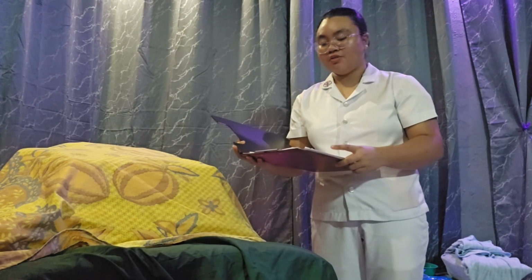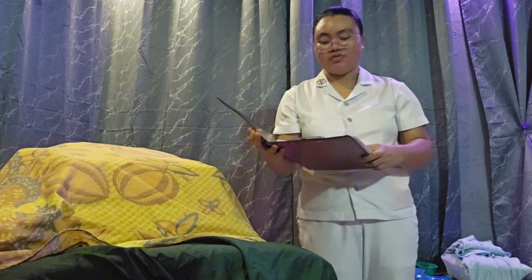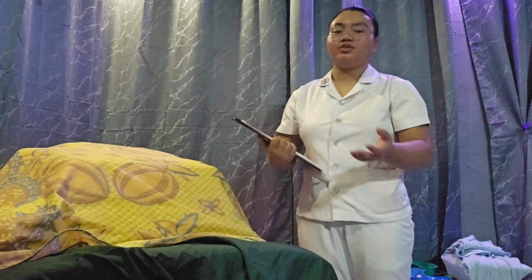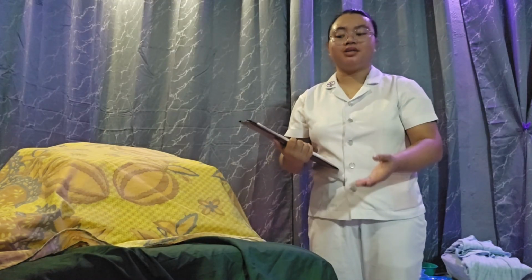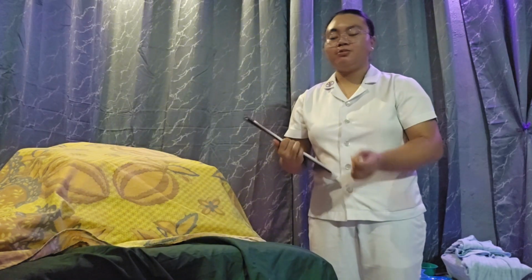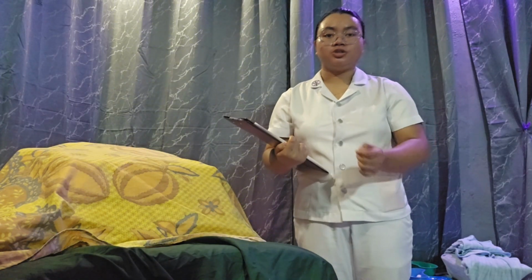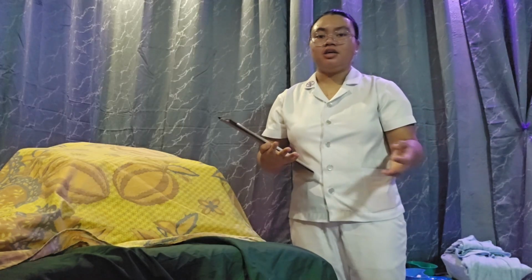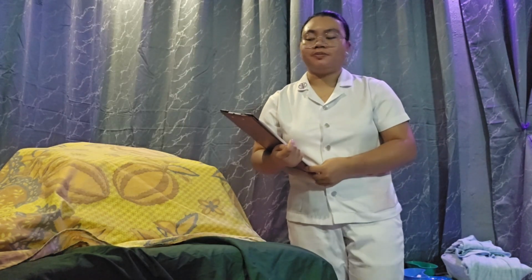So after checking and verifying the order of the physician, we are now going to introduce ourselves to the client, verify the client's identity, and explain the procedure to help the patient know and understand the procedure that we are about to do, ensuring that we provide the correct procedure to the right patient. And this also promotes cooperation.